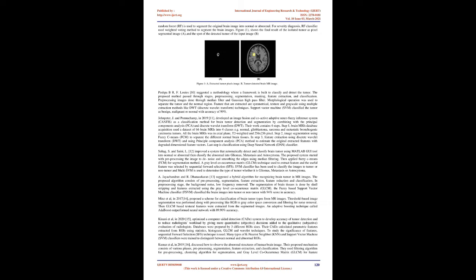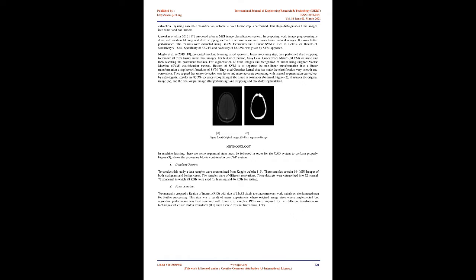To automatically analyze and distinguish what may not be observed by the human eye, image processing software is used, and the basic eyeballing of X-rays is abolished. Aspects such as volume, diameter, and vasculature of a lesion or organ are determined via image analysis and processing associated with the suitable image technique and diagnosis.